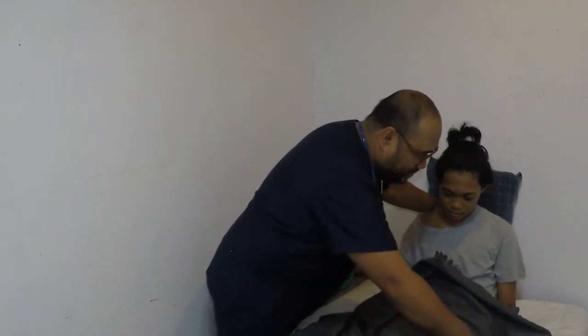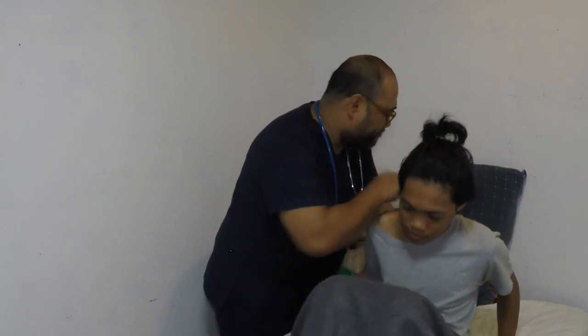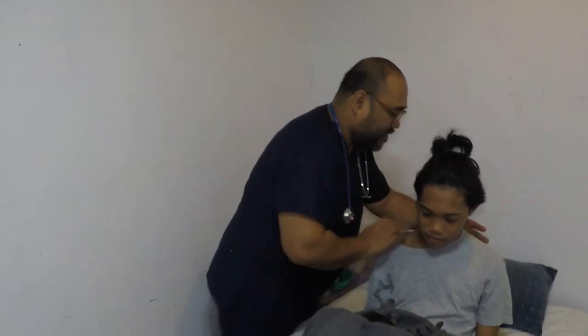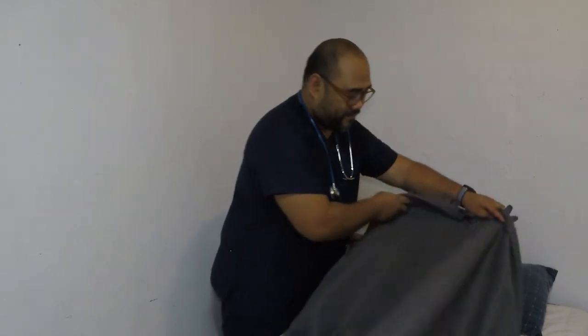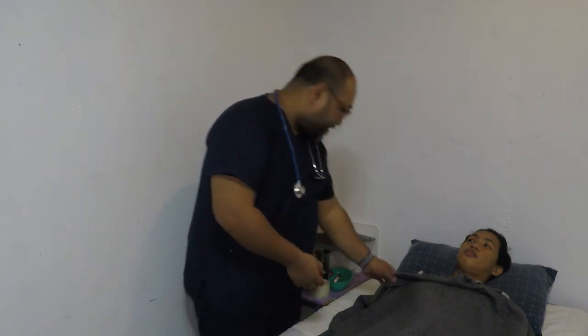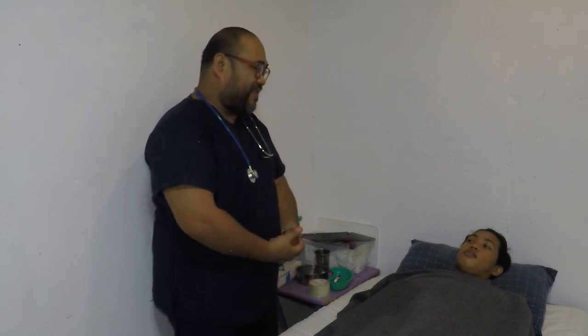Okay, sir. Slowly. Slide your body. And then our client is now fully fed and comfortable. Sir, thank you so much for today. We will go back tomorrow to do the procedure again.